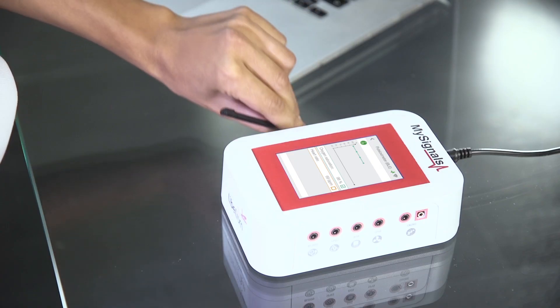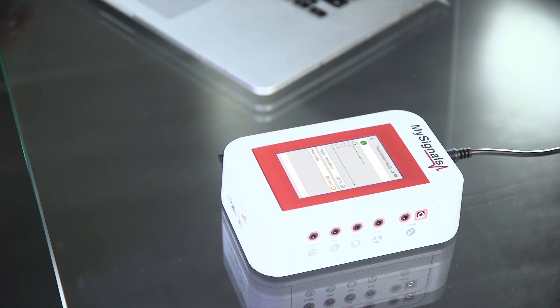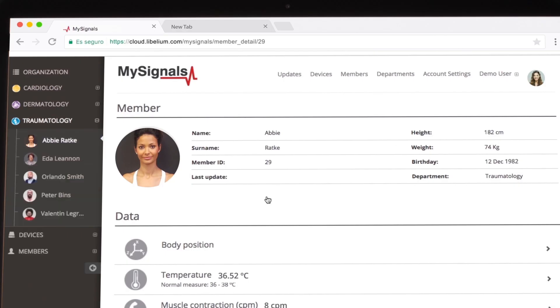Remember, you can also send the data to the cloud using the Wi-Fi mode and a standard access point, or send it to the app via Bluetooth.